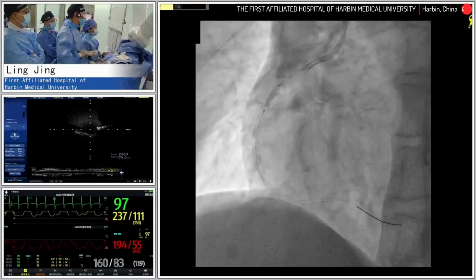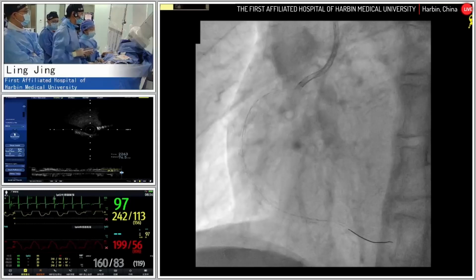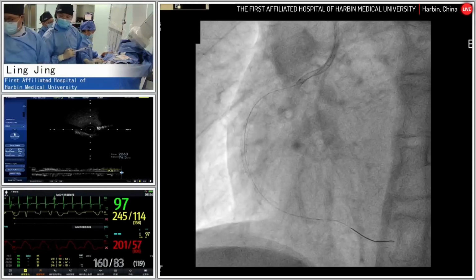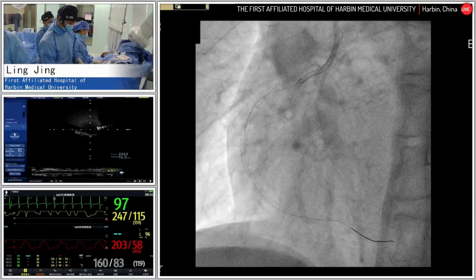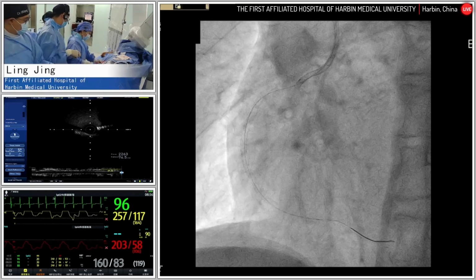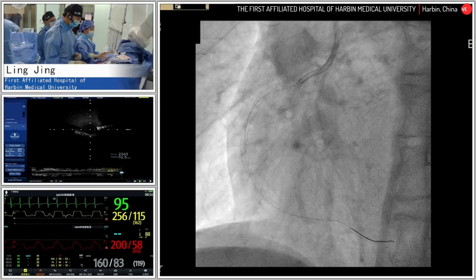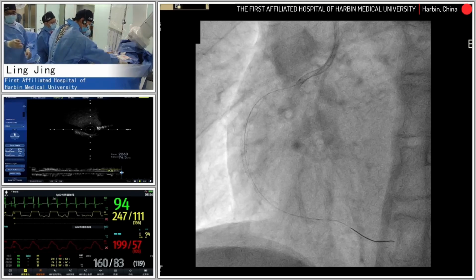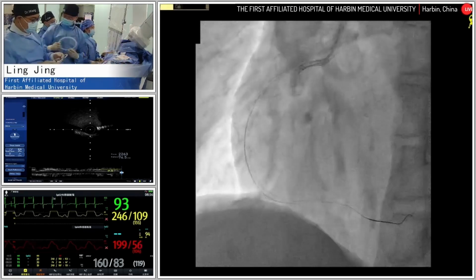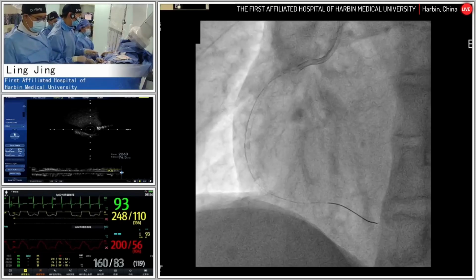Okay, and I noticed that there is a question from the online audience asking whether we have some made-in-China microcatheters, which are devices that we manipulate in China. Yes, we have. One of the microcatheters of potentially good use that is made in China is called the Instant Pass, made by Huitai, a medical product company in China.